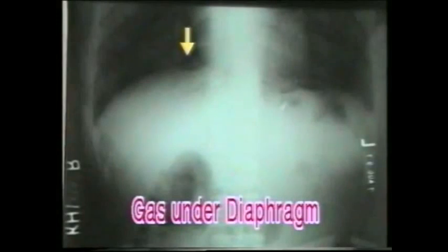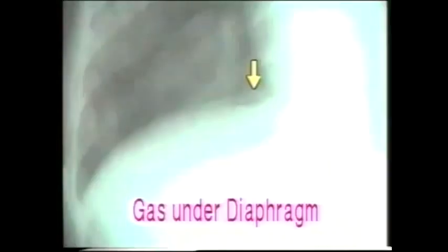In this x-ray, note the very small amount of gas under the right diaphragm. A careful inspection is required to detect small leaks. In the close-up view, observe carefully for the tiny gas shadow between the diaphragm and the liver.